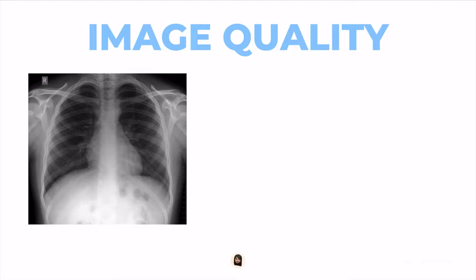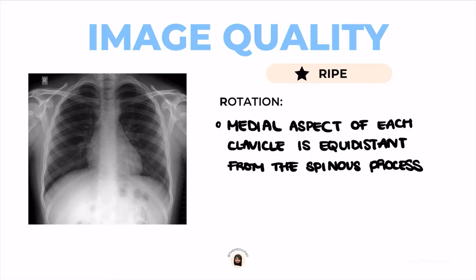In order to read an x-ray, the quality needs to be good, and in order to check that, we need to follow an acronym called RIGHT. R stands for rotation, and we check that by looking at the medial ends of each clavicle, right and left, and looking at the spinous processes of the spine, and making sure that these two are equidistant.